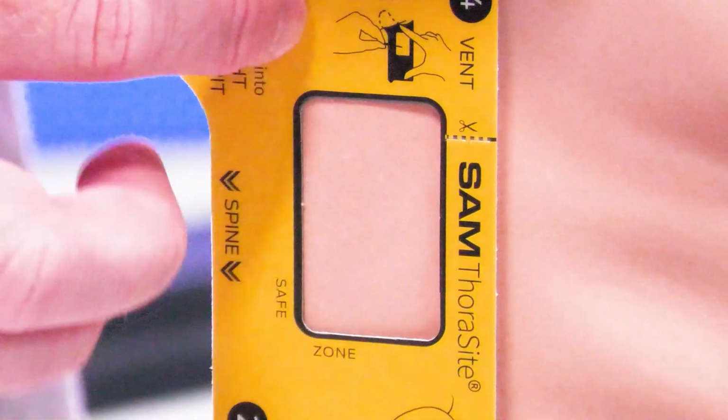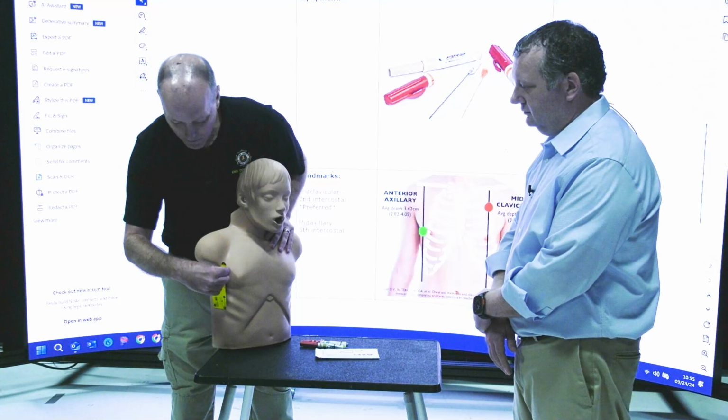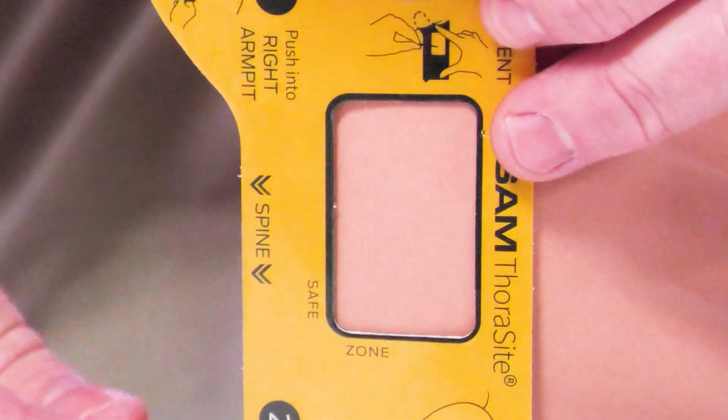But like the doc was saying, if you're in the correct spot, if you notice, I can read everything. If I flip it over, the writing is backwards, and look how high I'm going to be up. Now I'm up in here. Remember, this has got to be aligned with the hip. This is not in line with your hip. This is going to be in line with your hip.